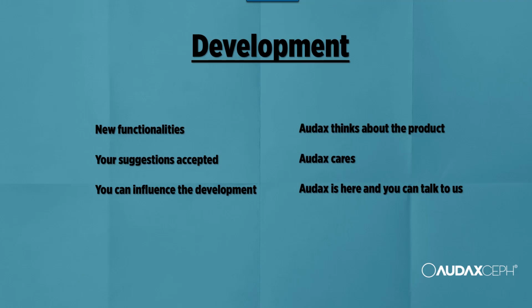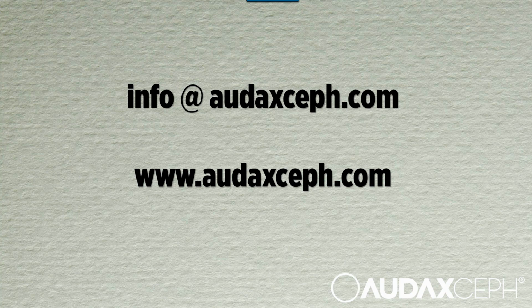Audax develops its orthodontic software suite all the time. This assures you that there will be new functionalities available, such as automatic tracing, quick support, issues solved, your suggestions accepted in future releases. If the software is being developed, there is someone you can talk to, someone who cares about the product. Look, AudaxCeph offers, for example, automatic tracing, because we do the development, and the same with the other functionalities. I strongly encourage you to talk to us.